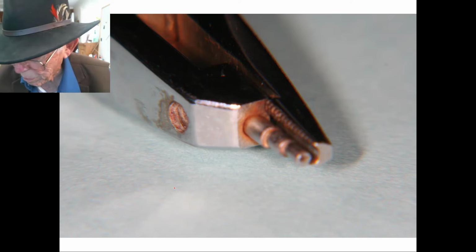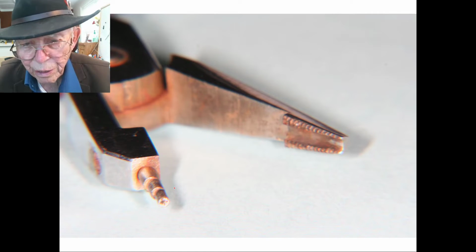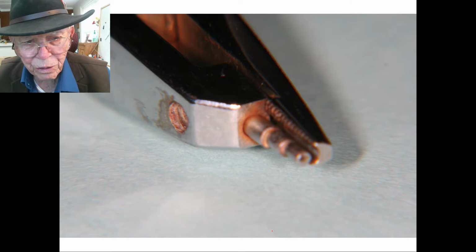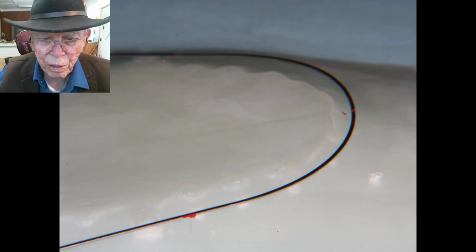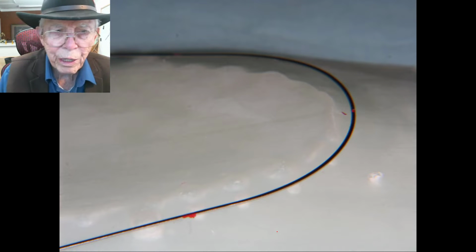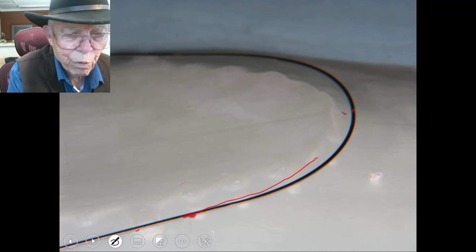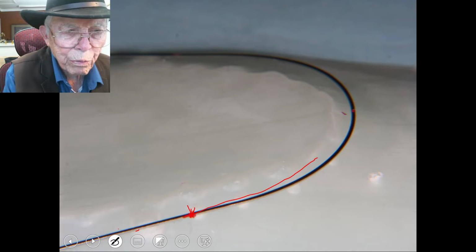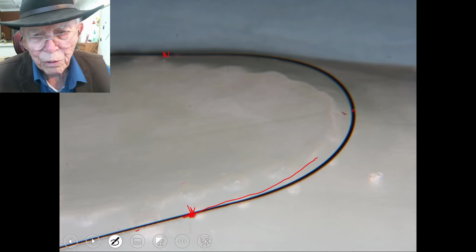Now let me see, I need to go back and erase that. And here we go. Now, this is just looking straight at it. Here is an archwire that we have set up on a wax pattern. Now, we show you in a video how to form the wax pattern, and we put a mark on the plier where we're going to make this loop, and we'll also go over and mark the side over here, but I don't see it on there.